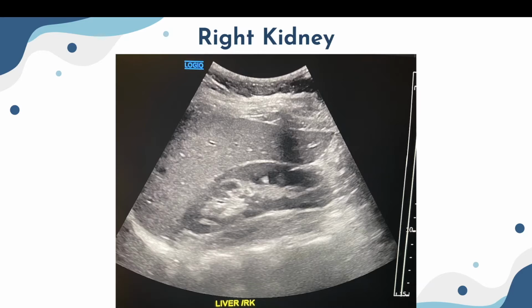The technology has changed. The resolution has become so much better with the machine quality. We have a GE machine today, but GE, Siemens, or Toshiba, they all have different bells and whistles that were not there a few years ago. So, improved resolution, improved color flow, improved Doppler. The technology itself has changed as far as the screen layout and the ergonomics of the machine, and it just helps the scan go faster and quicker.